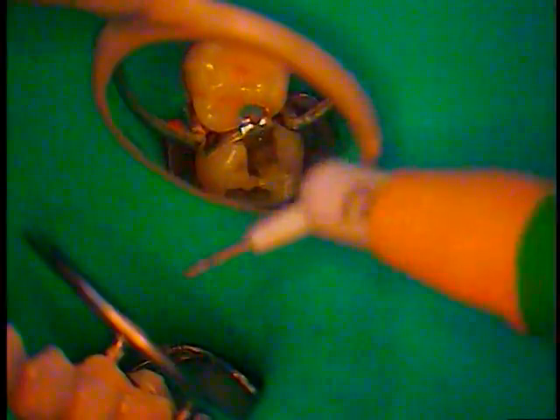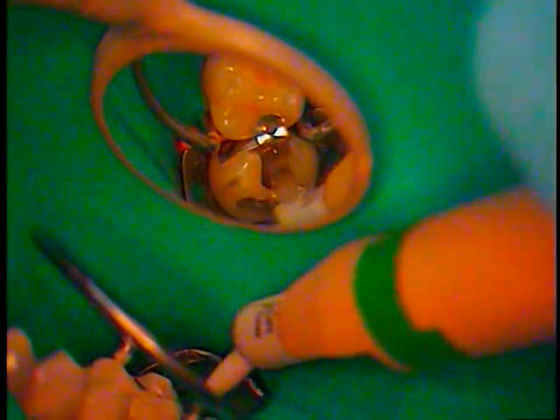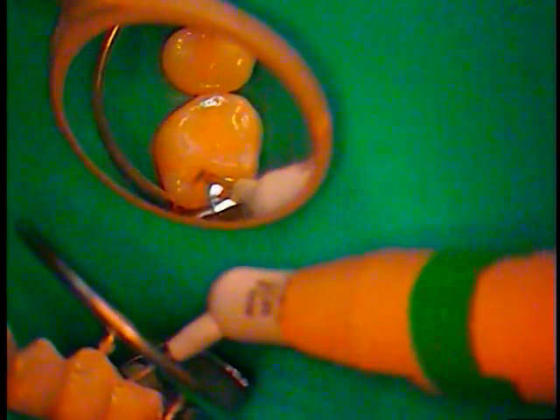I'm going to add posterior flowable, same company. I want to reduce the ability to have any voids. Just don't want any voids underneath my filling, just small amounts in critical areas. This is difficult—it is a macro type.